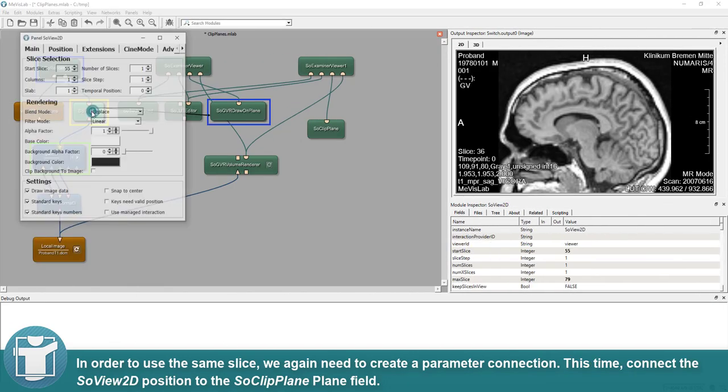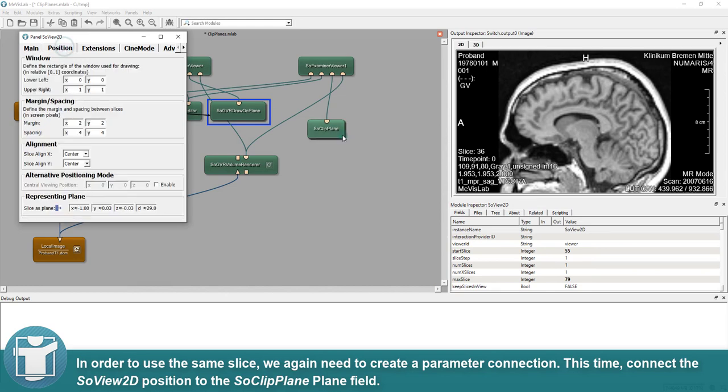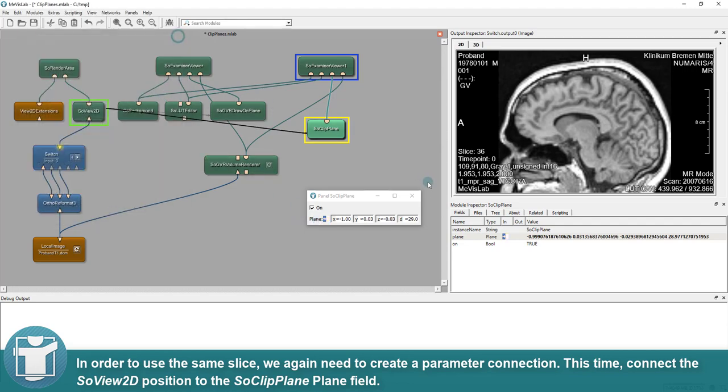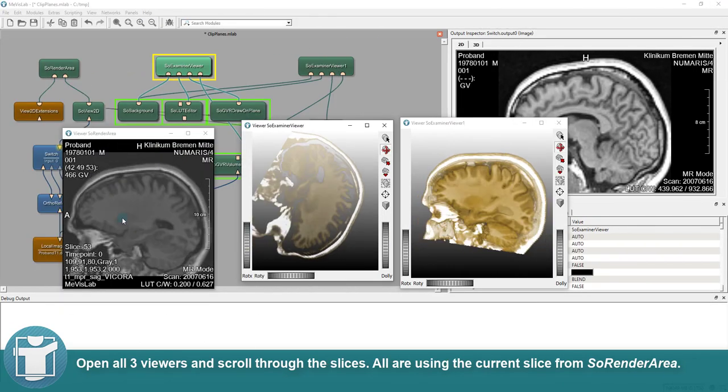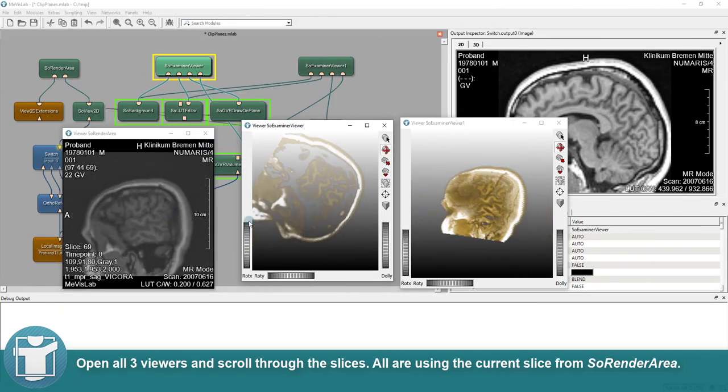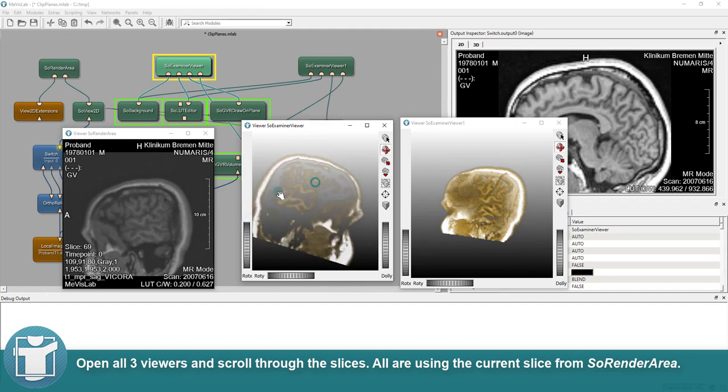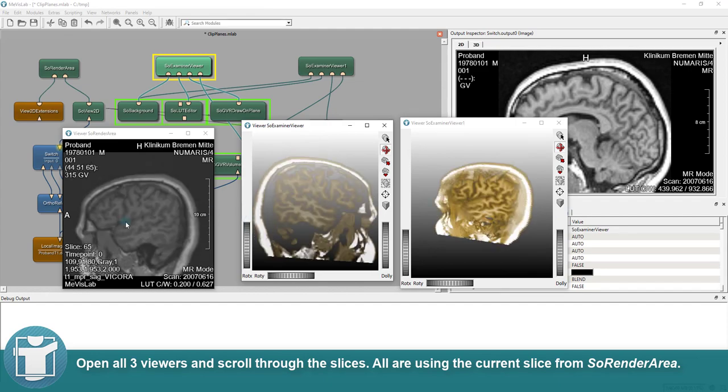In order to use the same slice, we again need to create a parameter connection. This time, connect the SO View 2D Position to the SO Clip Plane Field Plane. Open all three viewers and scroll through the slices. All are using the current slice from SO Render Area.